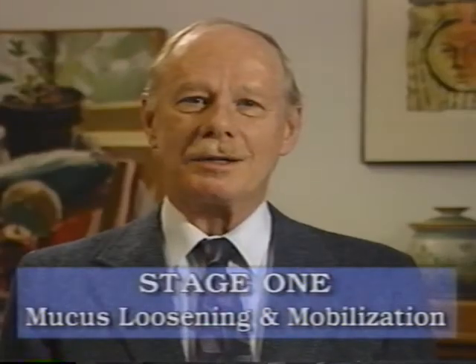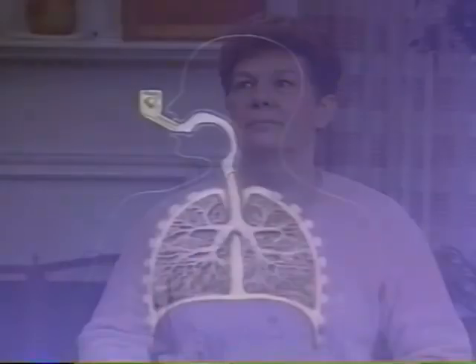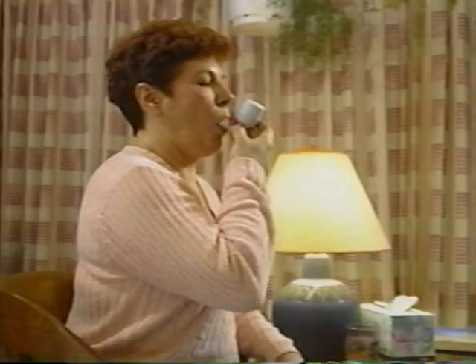Stage 1 is mucus loosening and mucus mobilization. Begin by being relaxed. Sit with your back straight and head tilted slightly upward, so your throat and windpipe are wide open. This allows exhaled air to flow smoothly from your lungs out through the flutter. Put the flutter in your mouth with your lips closed around the stem.